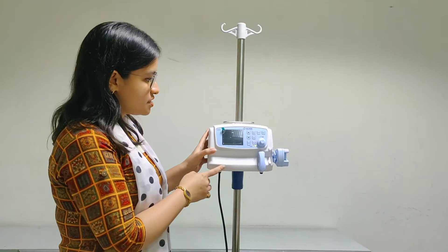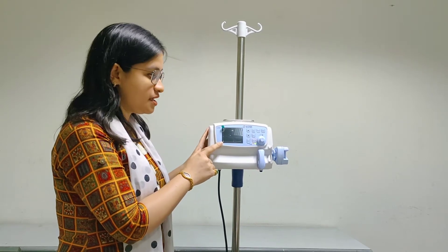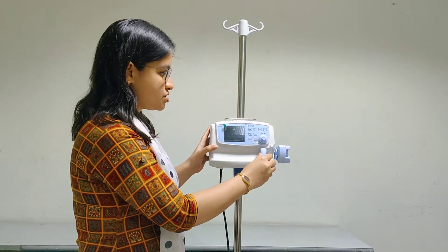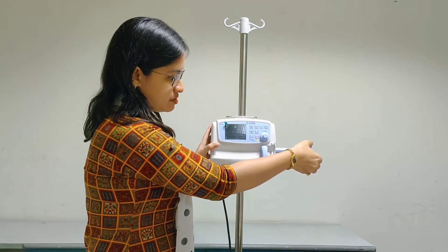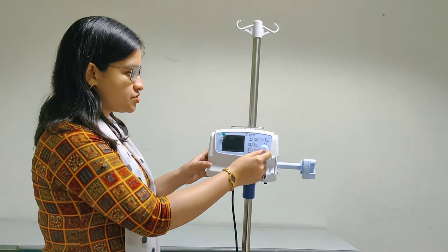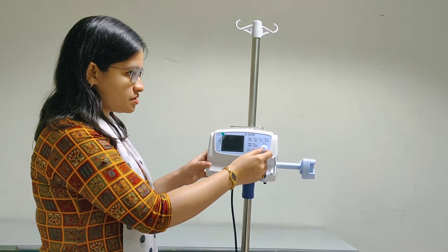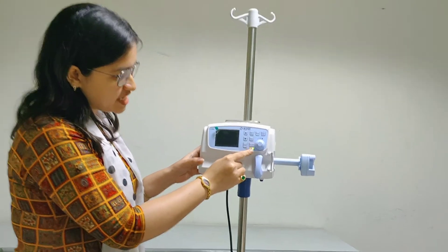Now we will look at the different parts of the syringe pump. This is the 3.5 inch LCD display. This is the syringe holder. And this is the plunger. This is the trim knob, which is used to set the value of the syringe.